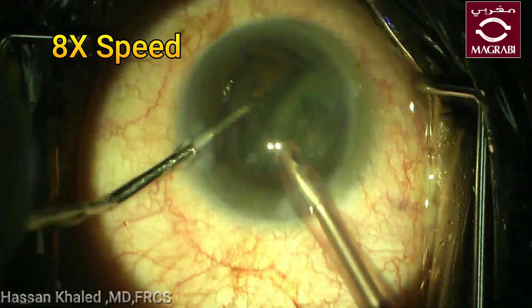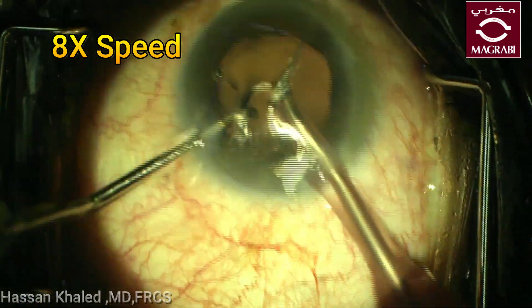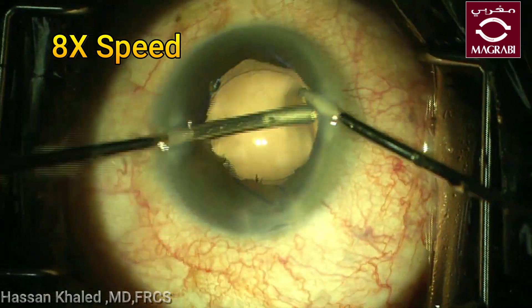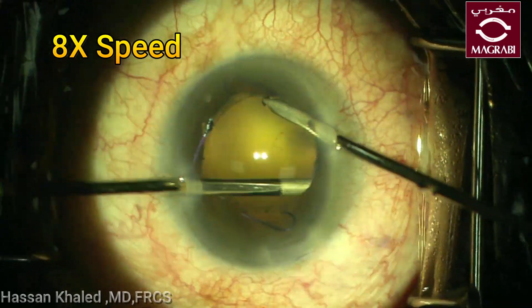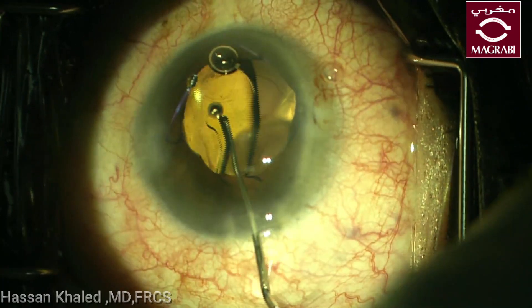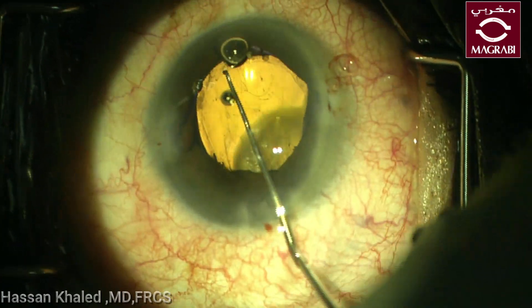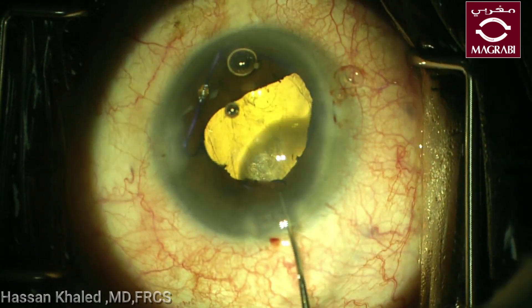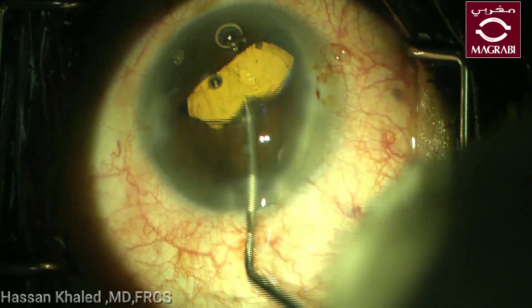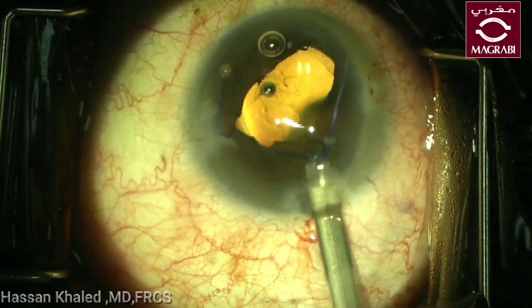Then after removing this cataract, washing the cortex using bimanual irrigation-aspiration, then a single-piece hydrophobic IOL was implanted inside the capsular bag. Now, before washing the viscoelastic material, it is time to remove the Malyugin ring using the injector of this ring.